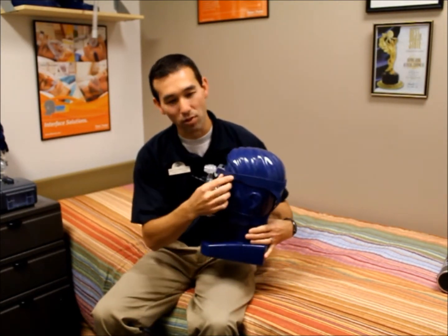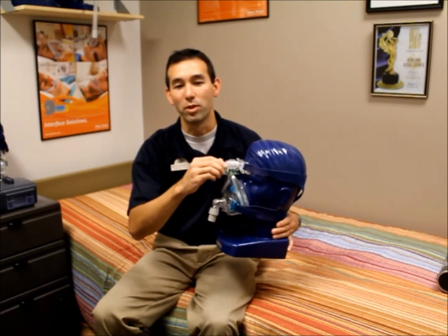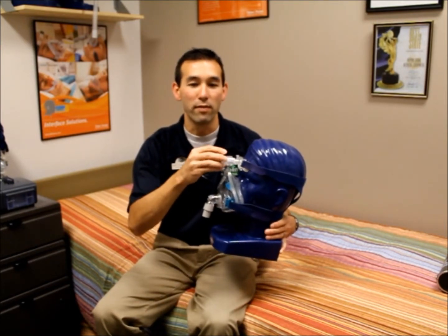To resolve a leak by your eyes, adjustments can be made to the upper strap of your headgear. To resolve a leak by your mouth or chin, adjust the lower strap. Some masks have an adjustment built into the mask which changes the angle the mask sits onto your face.